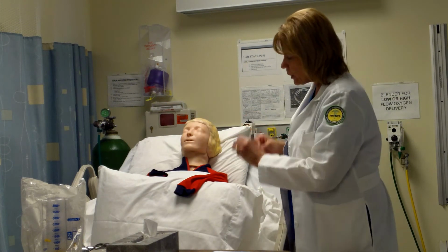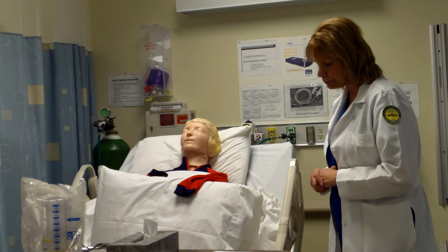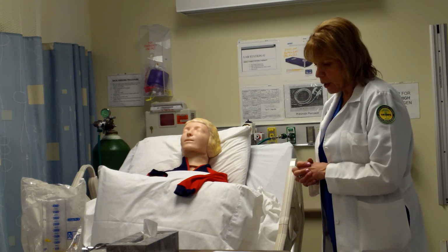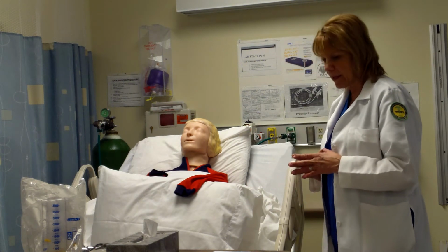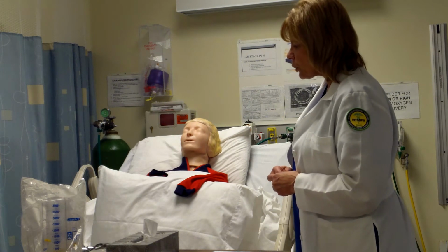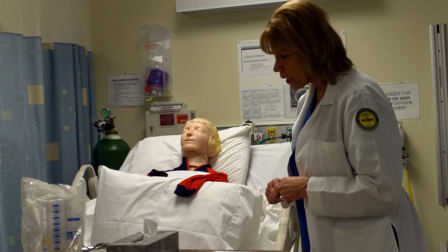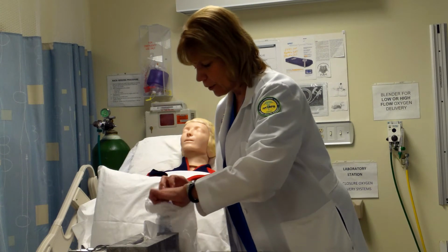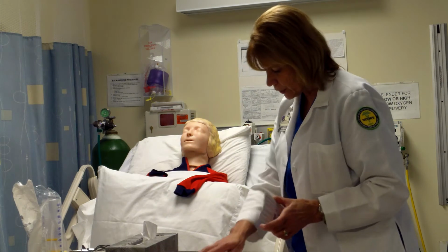All right. So as I'm doing this, I would be documenting on my SOAP note. I'll talk about that at the end, and how I want you to document. All right. So I'm going to ask my patient a couple of questions now, because I've decided that being a post-op and having some incisional pain, I might evaluate her to see if she needs incentive spirometry. So I'm going to open this package up right now, and I'm going to get out the directions, and I'm going to ask my patient a couple of questions.